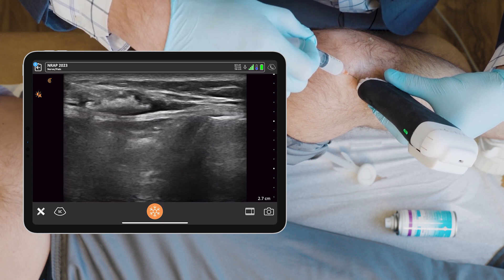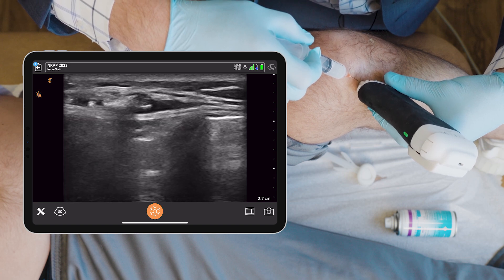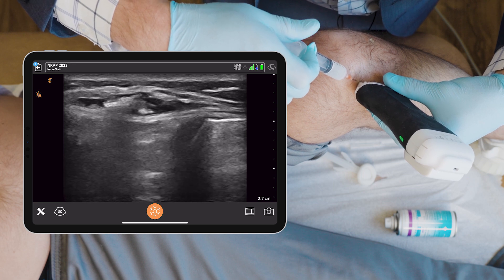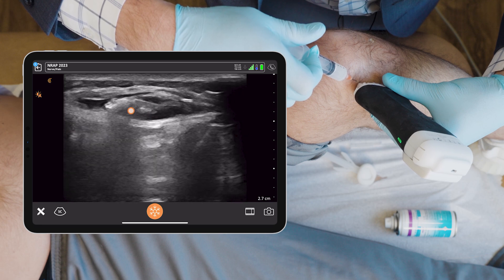Feel that, John? And I'm in the plane of the nerve. I'm very close to the nerve right now, injecting right above it. You can see the nerve under my needle tip, and the black is the local anesthetic.